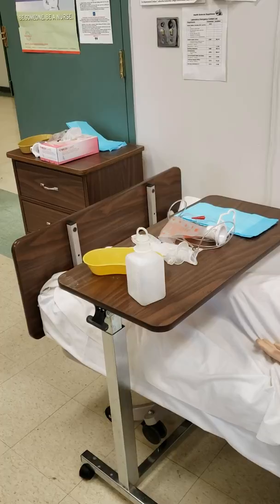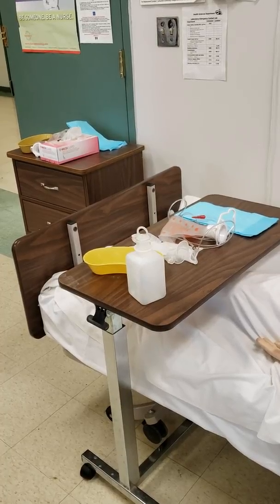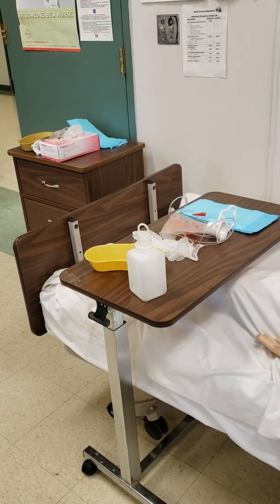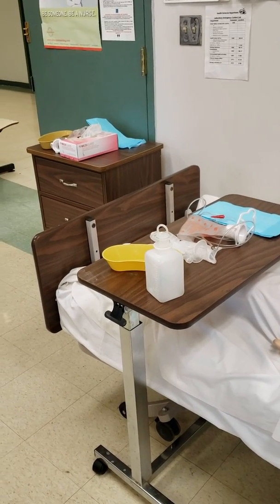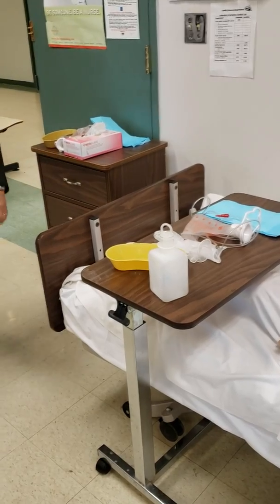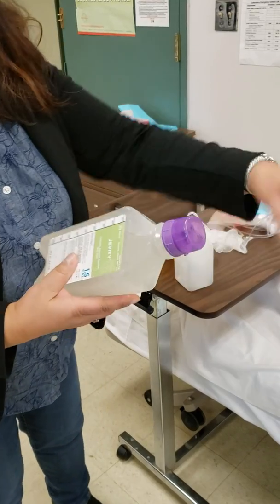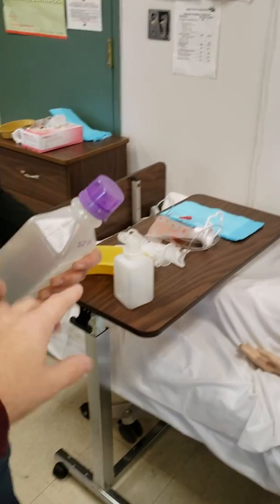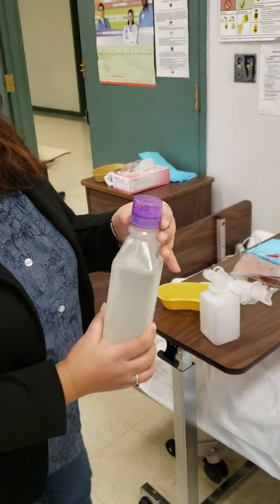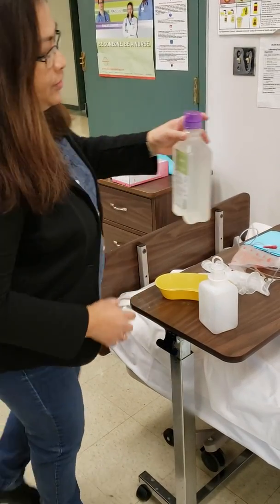I was like, oh, what is happening? Do you remember if? The bottle is this one, but usually this is water. It's milky. Oh yeah. Oh, all right. Thank God that you saw it. All right.